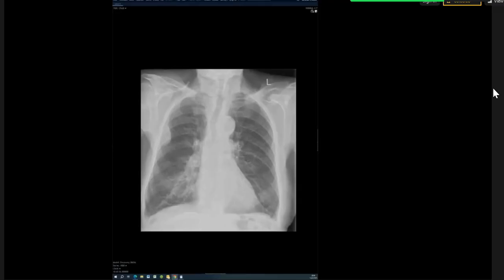Isn't myeloma plasmacytoma a purely lytic lesion? Why does it appear soft tissue density in the final case? A lytic lesion is something that destroys the bone. When bone is destroyed, it doesn't result in air or fat. It looks like soft tissue. So it doesn't calcify. It's just the bone expands and it can look like soft tissue. Miliary can be ground glass.